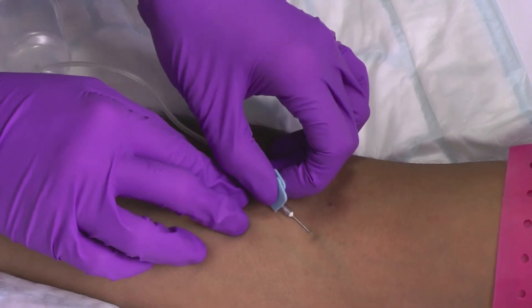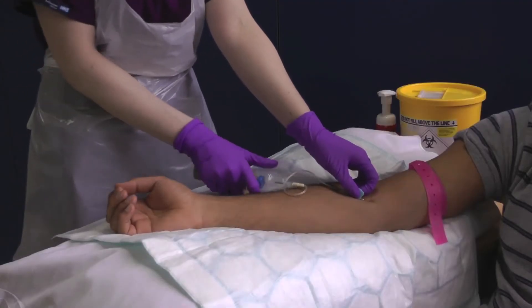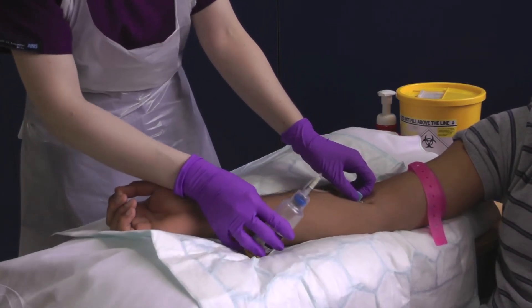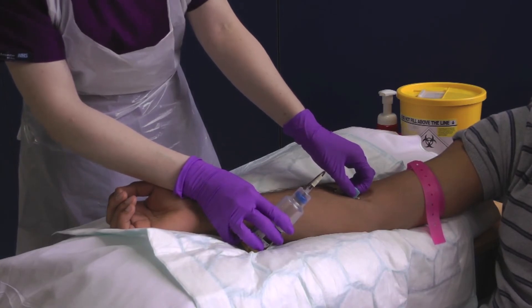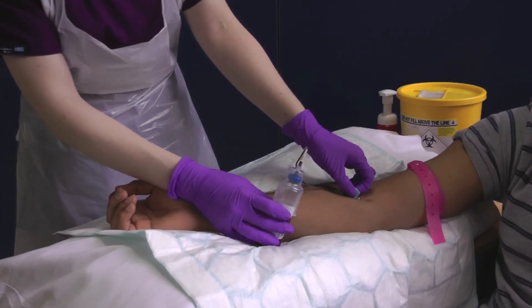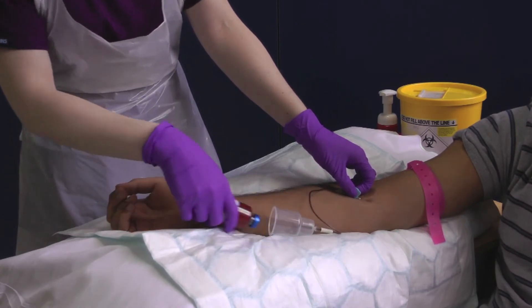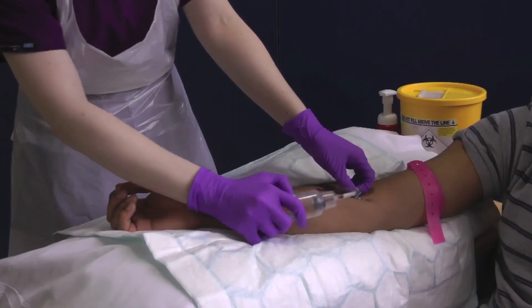Once the needle has punctured the vein you can release the traction on the patient's arm. Whilst immobilising the needle with one hand, take the aerobic blood culture bottle and pierce the septum using the adaptor cap. It is important to fill the aerobic bottle first as there will be air within the collection set. Hold the bottle upright and collect 10ml of blood. Remove the aerobic bottle and repeat the procedure with the anaerobic bottle.